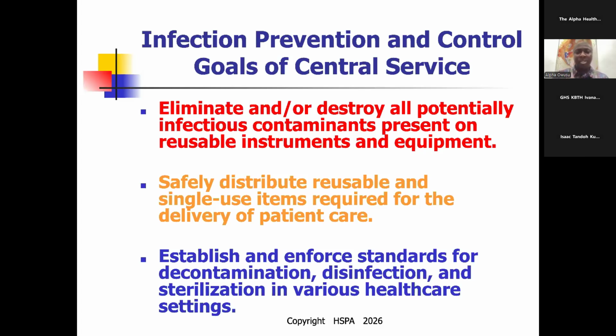Use the right brushes, use the right equipment, right? Use the right steps, microscopes, right? Inspecting it, going through all those processes from decon, the right disinfection, moving from the chlorine and using enzymatic solutions where the activation of the enzymes will break the surface of the soil.